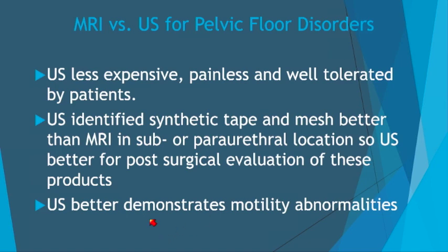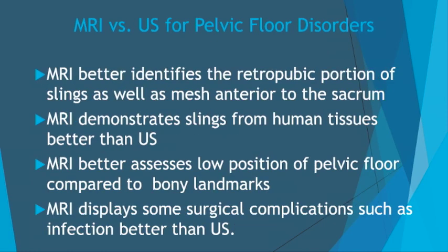Furthermore, ultrasound is better in identifying movement. So if you have some kind of dysmotility, as I've shown you in the slides, it's an excellent way to be able to show that in real time. But MR definitely has a place in pelvic floor disorders, and what we found in our experience is these are the areas that we particularly like to do MR.